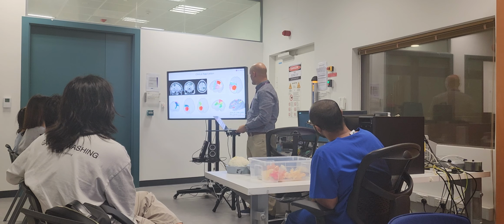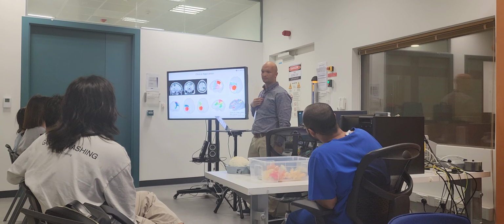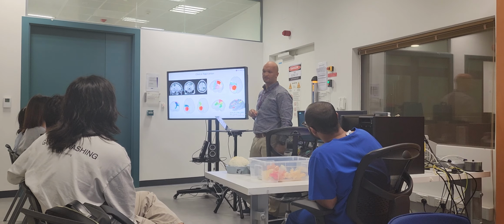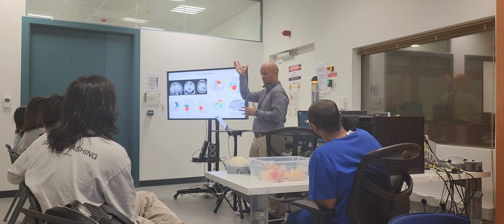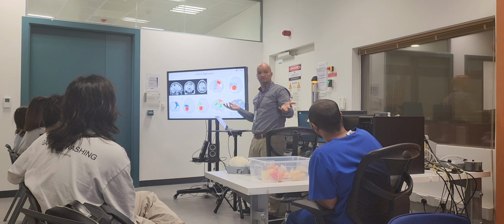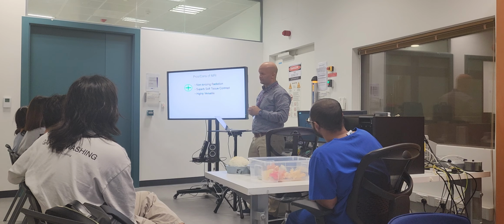Here's a functional MRI. I'm taking a sagittal cut. The red stains are the result of the language functional MRI, and the yellow stains are the terminations of the superior longitudinal fasciculus. So we overlaid structure, function, and structural functional connection. That is an application of MRI in real time. It can happen to anyone else. Any one of us can end up with a brain tumor. So this is a quick overview of what we do.